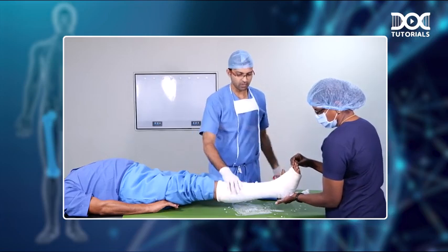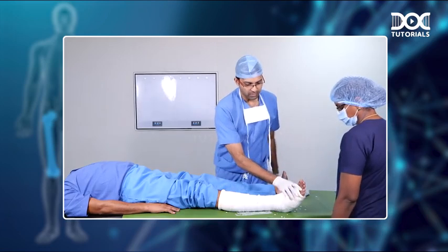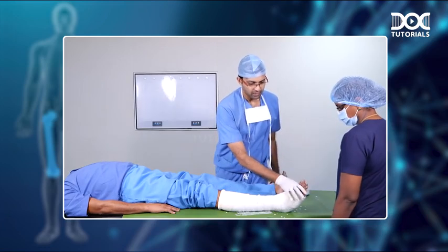So that's it. That's your below knee slab. You make sure that all the toes are outside and it is well mobile.